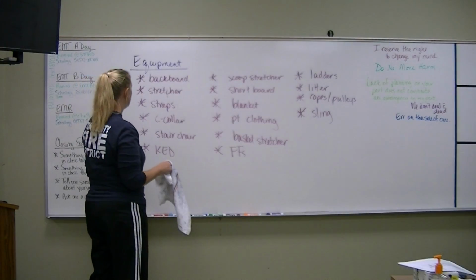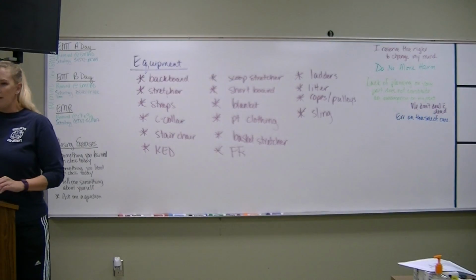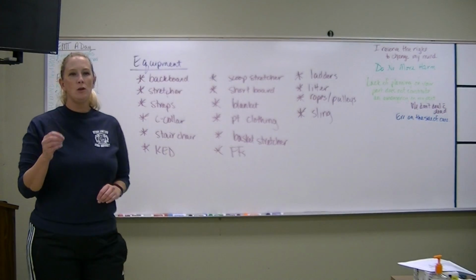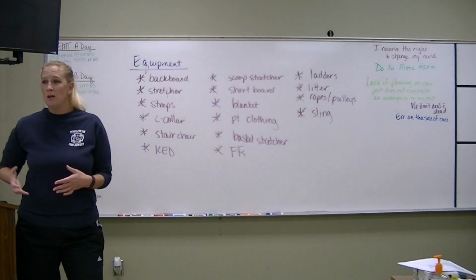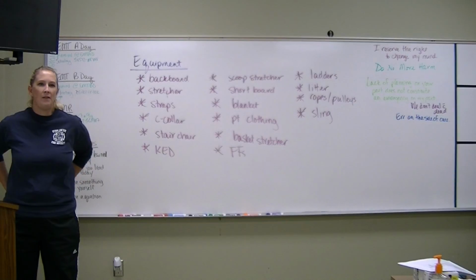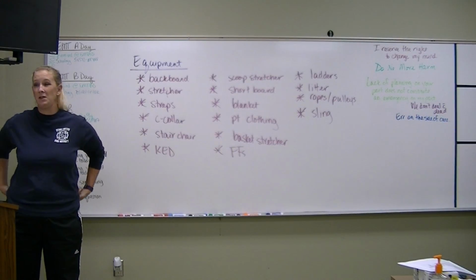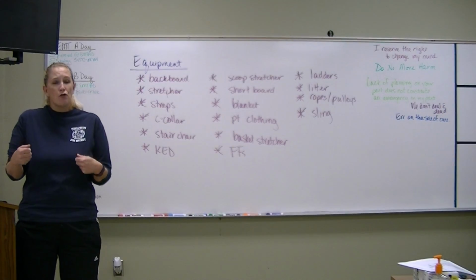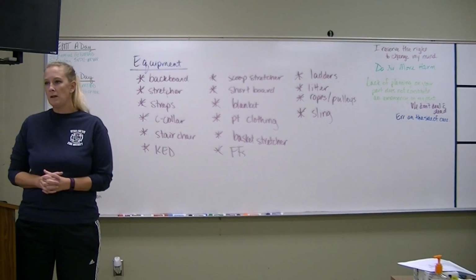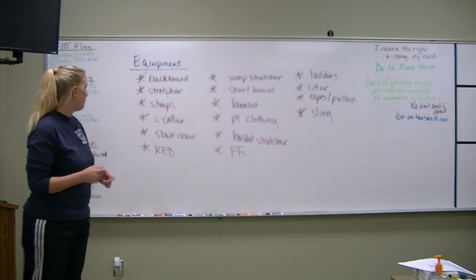Okay, let's talk a little bit about the stretchers. Most ambulance stretchers are what is most commonly used to move or carry a patient, because they're designed to carry someone who weighs up to 500 pounds or 350 pounds, but bariatric stretchers are designed to carry people up to 750 or 800 pounds, right? And when you get the patient lifted on there, they try to design them so that they roll fairly easily. So the stretcher is the most commonly used item to transport or move patients.